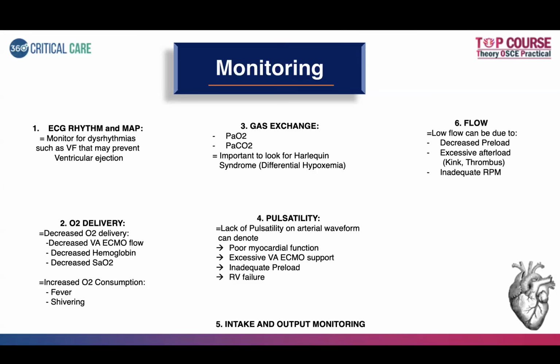The important thing is that a low flow alarm is a frequent issue that can occur, and you need to assess why it is present. Usually the causes are decreased preload, excessive afterload, that is the presence of kinking or any thrombus, or inadequate revolutions per minute. So it's the ECMO settings based issues.